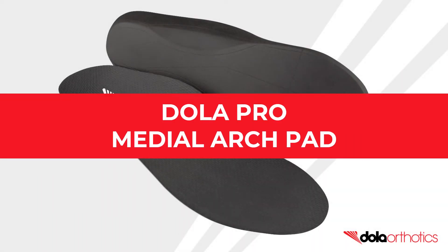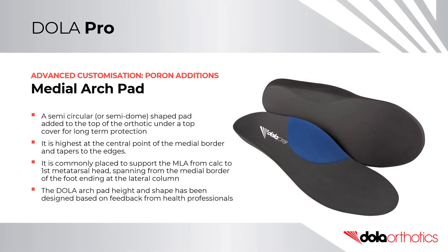A medial arch pad is a semi-circular or semi-domed shaped pad added to the top surface of an orthotic under a top cover for long-term protection. It is highest at the central point of the medial border and tapers to the edges. It is commonly placed to support the medial longitudinal arch from calcaneus to first metatarsal head, spanning from the medial border of the foot and ending at the lateral column. The arch pad height and shape has been designed based on feedback from health professionals.